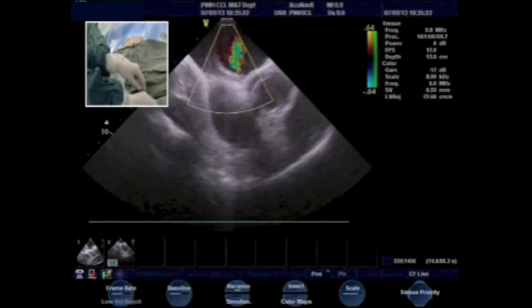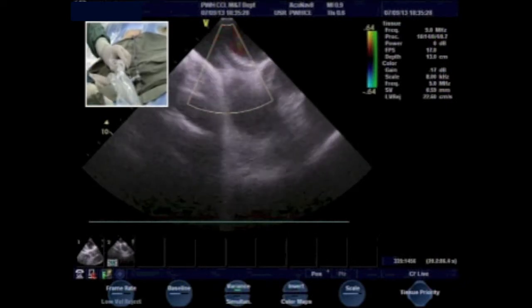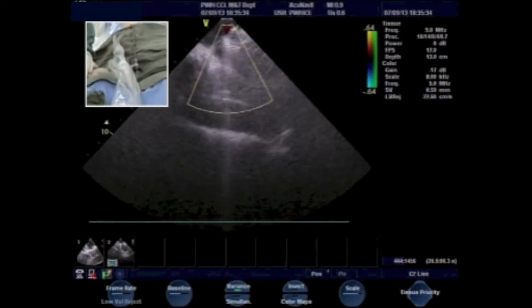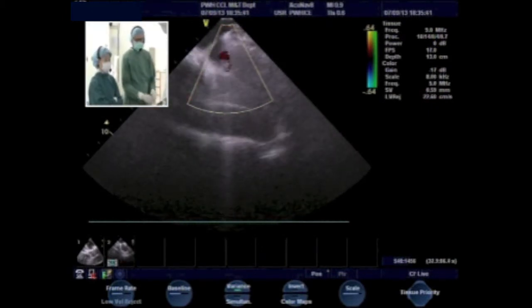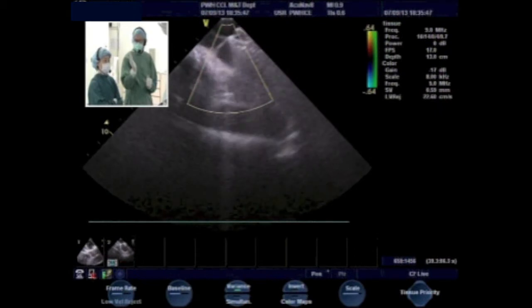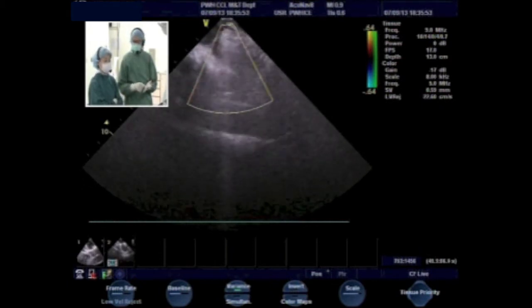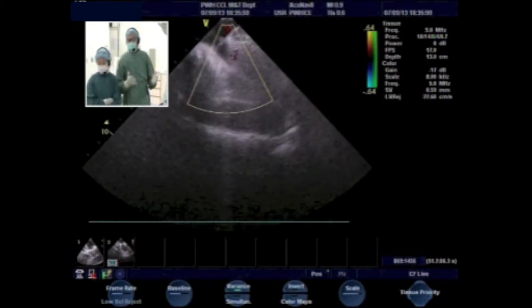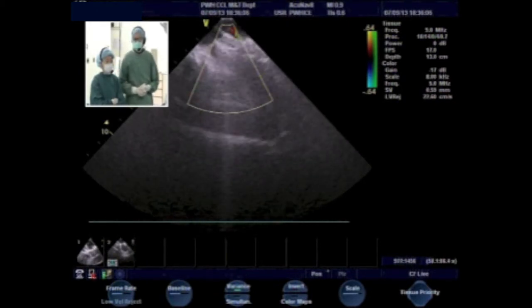Any comment? So, Dr. Lars, will you routinely assess the mitral annulus and the relationship between the mitral annulus and the edge of the device before you release the device? Not before we release it, because it's very difficult to judge, because you have tension from the cable and it changes position when you release it. But I do it before implantation. I check the rim to the aortic root, the posterior rim, SVC, IVC, and the mitral valve. And of course we need to have at least a 5 millimeter rim, except for the aortic root, where we can do it with a deficient rim.